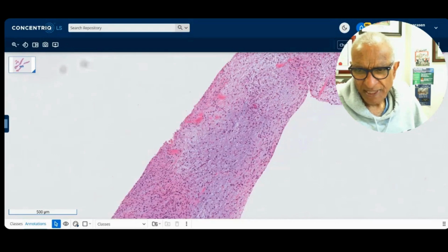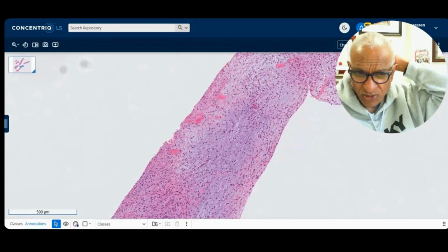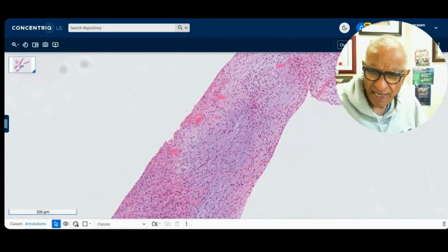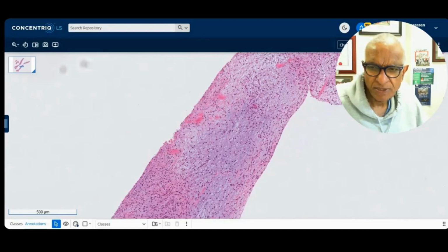There's no atypia. But your second differential is an absolutely correct one, the low-grade fibromyxoid sarcoma. MUC4, which is useful for screening and confirming these, is positive. Like I always say when I come out to Africa and teach, we have the luxury in our department of having a full FISH analysis. FUS, which is on chromosome 16, was rearranged. That rearranges with 7 and 16 in low-grade fibromyxoid sarcoma, with CREB3L2. So that's the fusion for low-grade fibromyxoid sarcoma, and that's what this is.